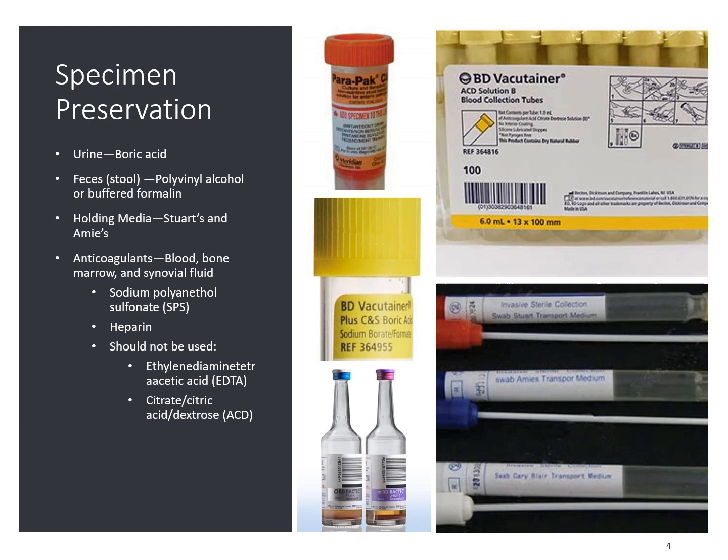And then you can also have a heparin tube, usually not an actual heparin tube, but a special tube for viral cultures, although you may not see viral cultures much within the lab. However, some of the things that should not be used would be EDTA tubes or ACD. Up in the top right hand corner, you can see an example of the ACD tube. Something like this should not be confused with those urine collection tubes that are also yellow.